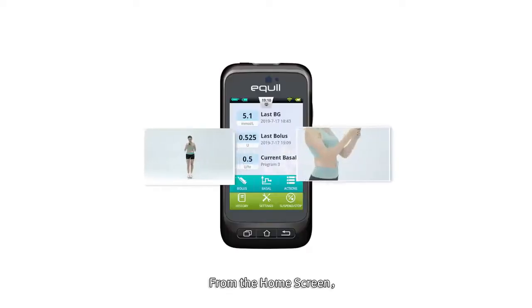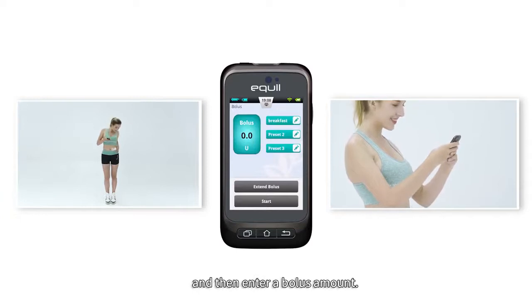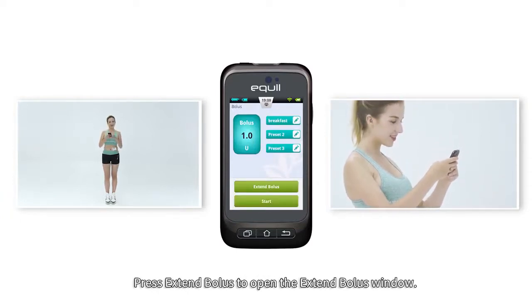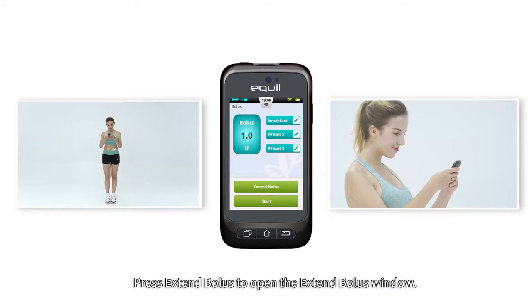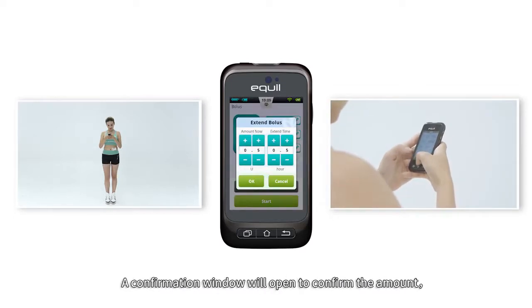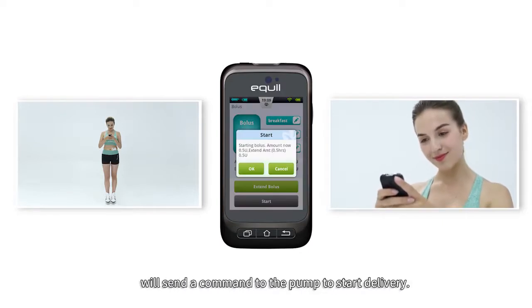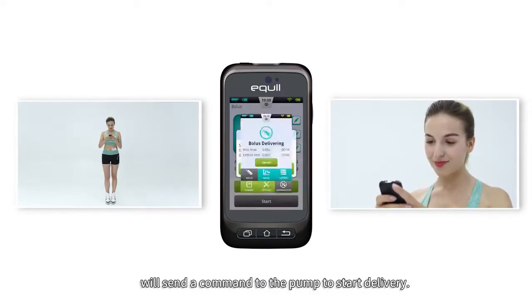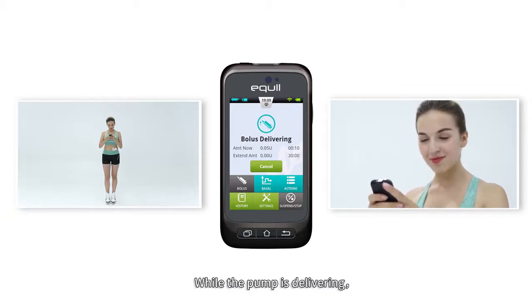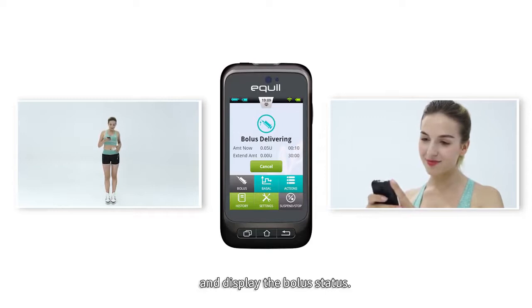3. Extended boluses. From the home screen, choose the Bolus button to enter the bolus screen and then enter bolus amount. Press Extend Bolus to open the Extend Bolus window. Choose the Start button to begin to administer the bolus. A confirmation window will open to confirm the amount. Choose OK to confirm, and the PDA will send a command to the pump to start delivery. While the pump is delivering, the PDA will revert to the home screen and display the bolus status.